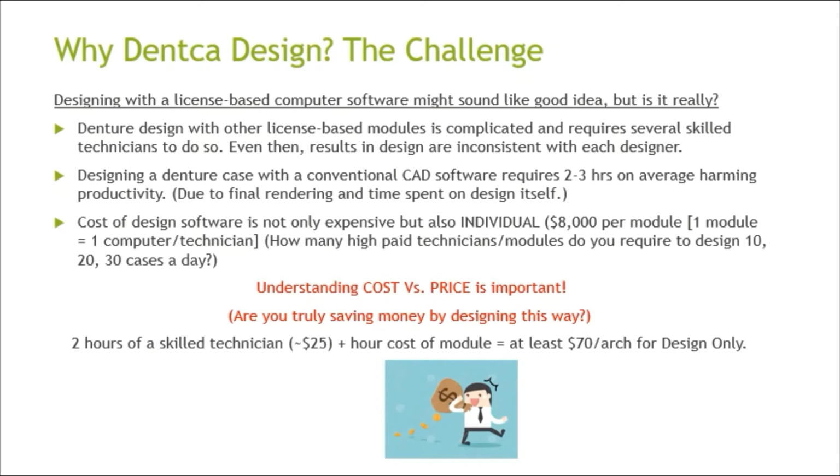The issues with conventional license-based computer software is that the denture design is complicated, it requires several skilled technicians to do so, and even the results are inconsistent. You can have 3 designers utilizing the same license-based software, and they could obtain entirely different results when designing the same denture. Designing a denture case with conventional CAD software also requires 2 to 3 hours on average.